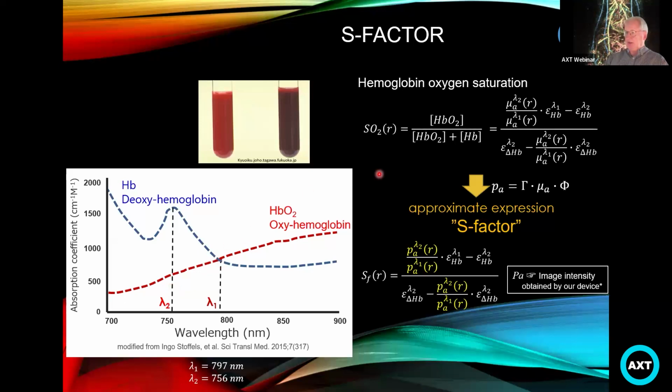This is then plugged into an expression looking at these differential absorptions to produce what's called an S factor, or saturation factor, which is looking at the oxygen saturation of the blood based upon the relative absorptions of the various lasers in producing a photoacoustic signal at these 2 wavelengths. Now, this is a relative, not an absolute figure, but even so, it produces very consistent results.